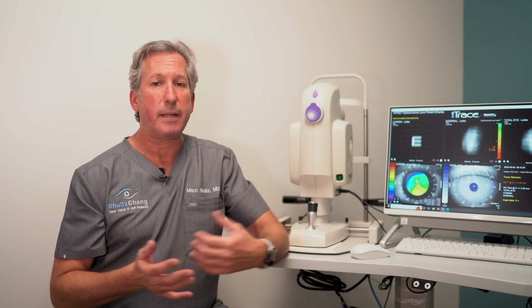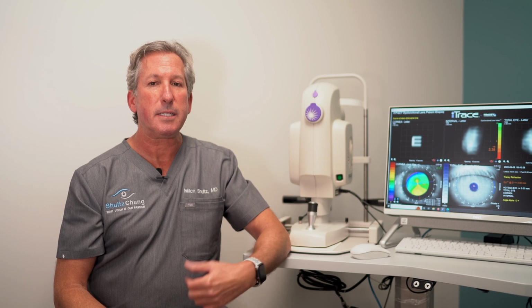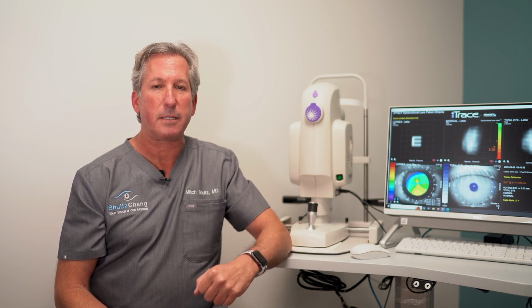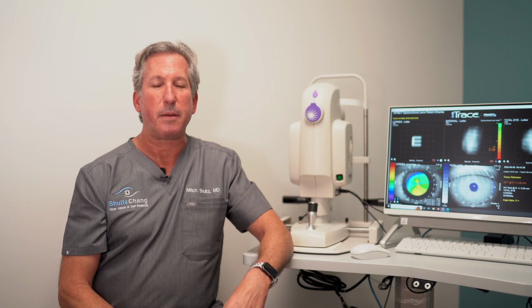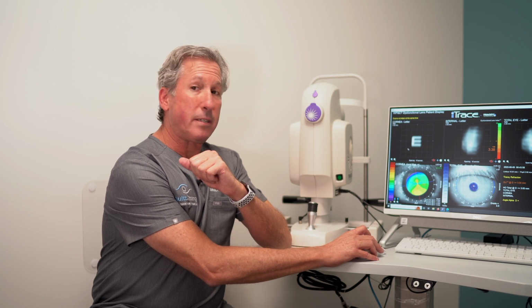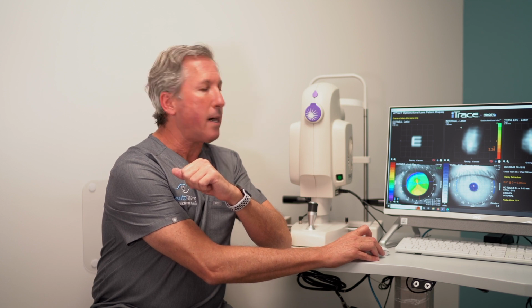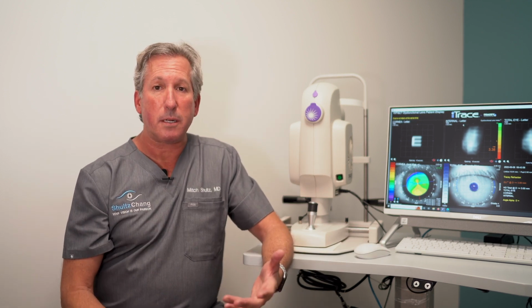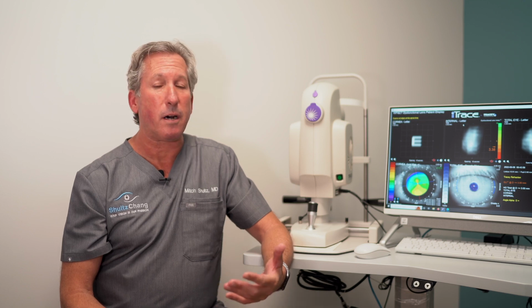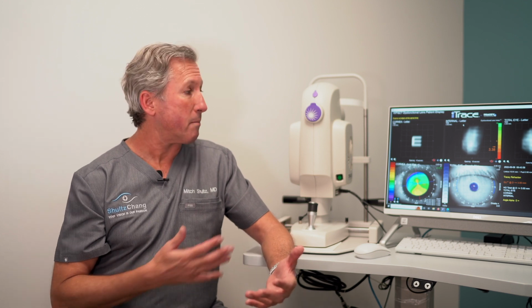We can also use it for looking at things that affect the visual pathway. One of the things that you can see on the screen here today is the dysfunctional lens index. This is something that we can use practically to counsel patients about where their vision problems are coming from. We can easily assess whether it's coming from the cornea, and you can see over here we have this E. Here, this is showing us where problems are coming from the cornea, or from the inside of the eye. The inside of the eye most commonly is coming from the cataract. However, it could also be coming from the vitreous, so we have to pay attention to whether or not patients may have floaters. And sometimes floaters can affect the DLI as well, so that's really important.